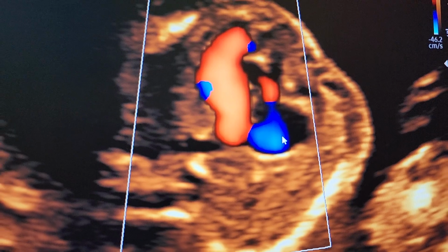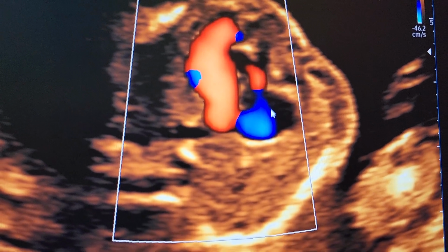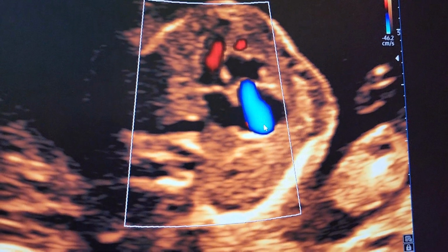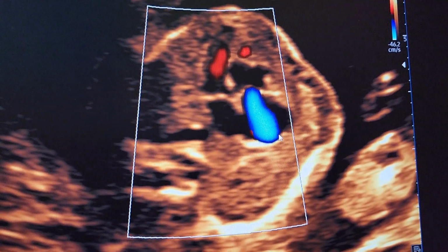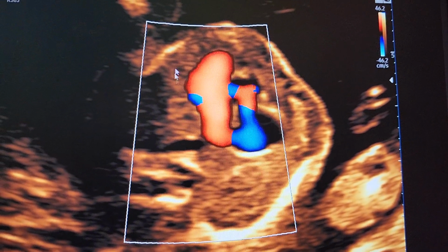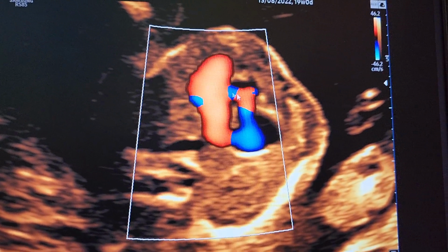The blue is the regurgitation taking blood back from RV to RA. So those are the events, and this is the large regurgitant jet. The jet reaches the roof of the right atrium. And this 4-chamber shows all the hemodynamics across both the valves.